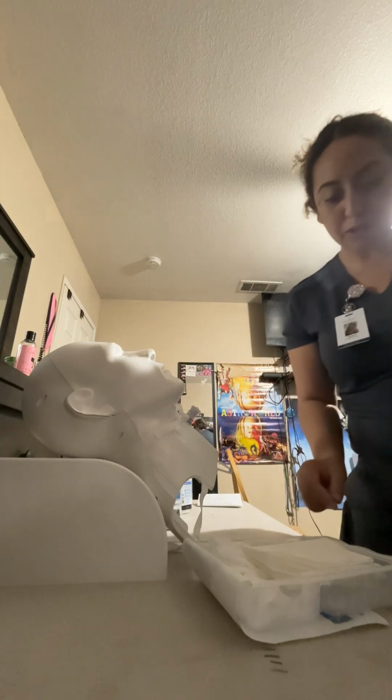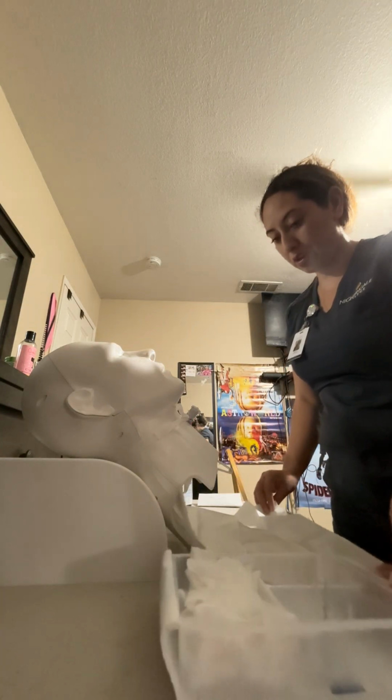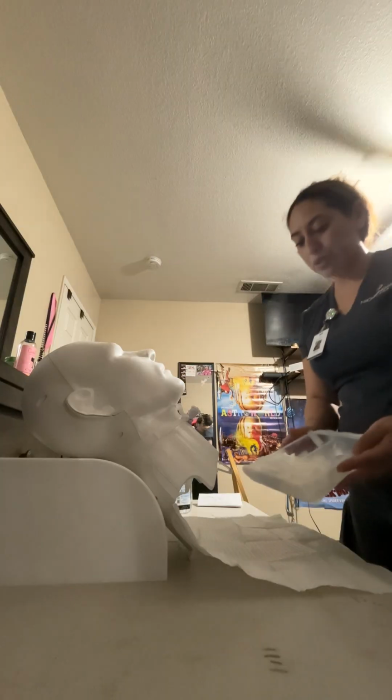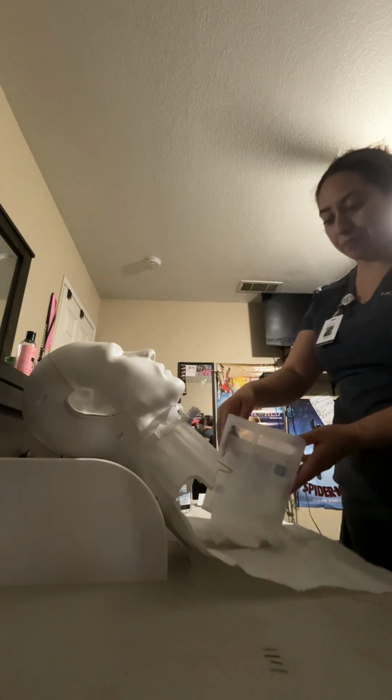I am going to open up the sterile drape, and I'm going to make sure that I have the shiny side up, and I'm going to lay that across my patient's chest. The other items that are in my trach supplies kit, I'm going to empty here onto the tray, onto the drape.